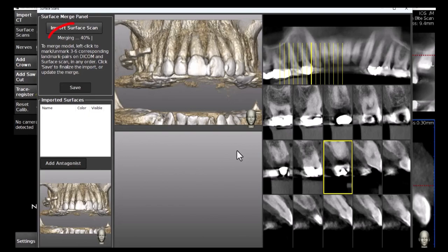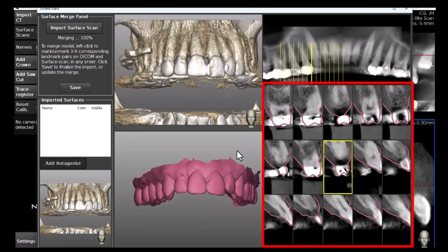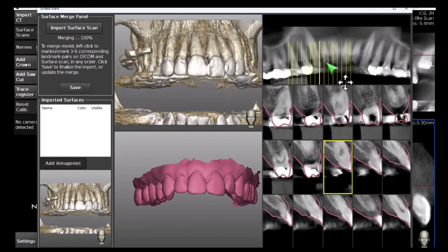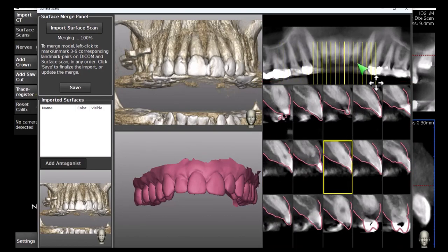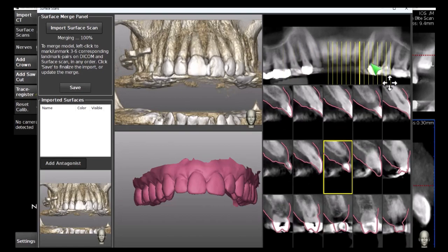We can see the merging process advancement in the upper left corner of the screen. Once the merging is complete, the result is shown in the grid view. We can now inspect the result by dragging the grid over the panoramic image and closely inspecting the merge accuracy in the cross-sectional views.